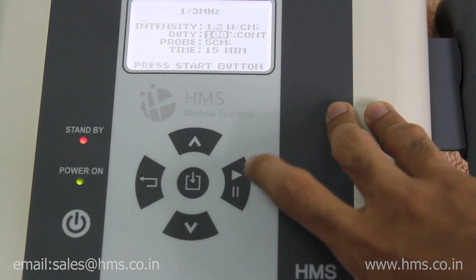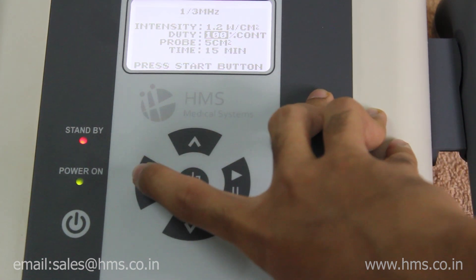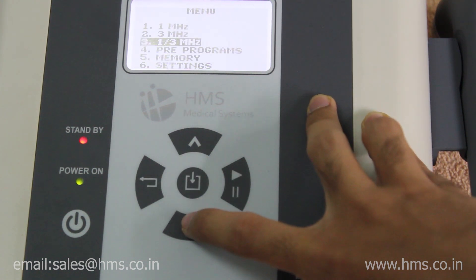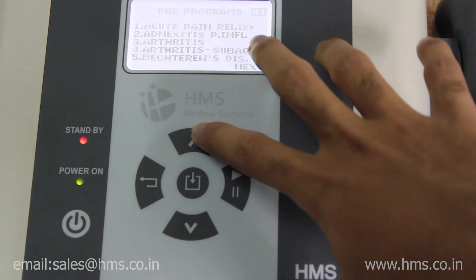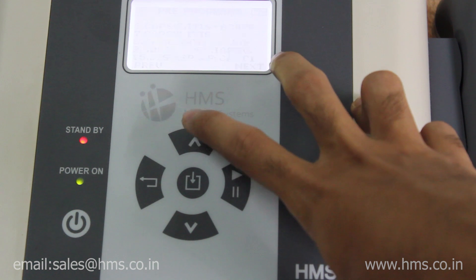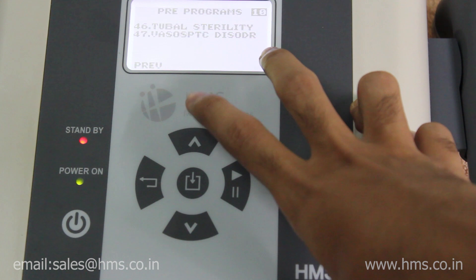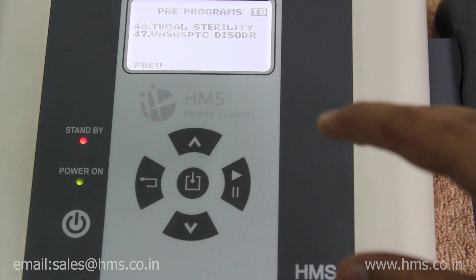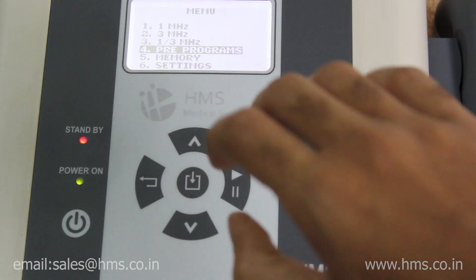Once the transducer is connected, you can start the treatment by pressing the start button. There are also a total of 47 pre-programs available with this machine. You can choose any one according to the ailment of the patient, making it really handy to use.